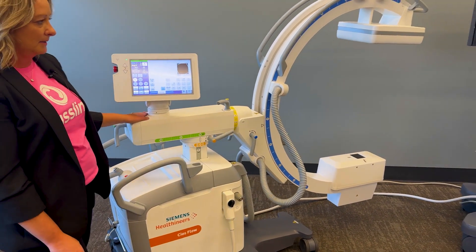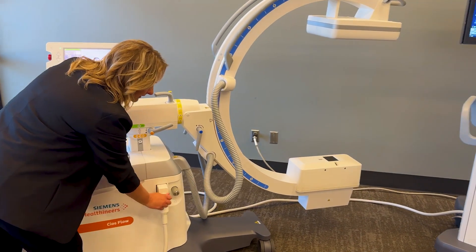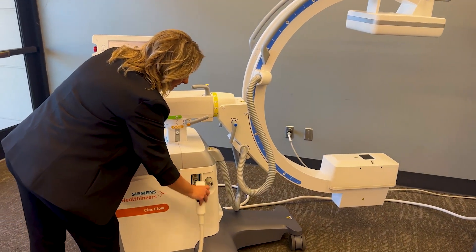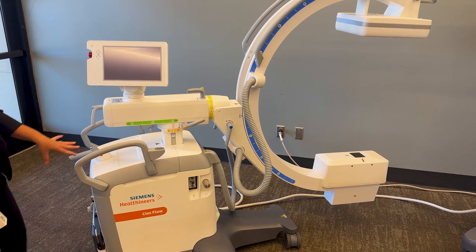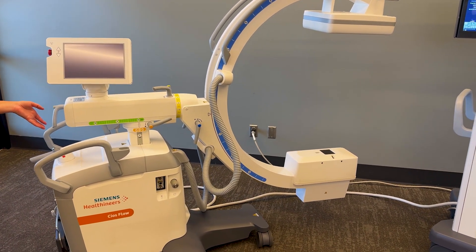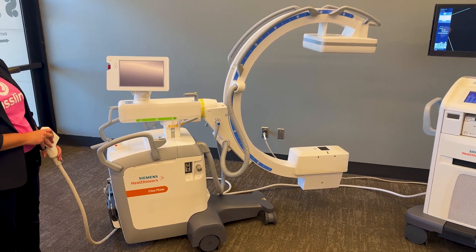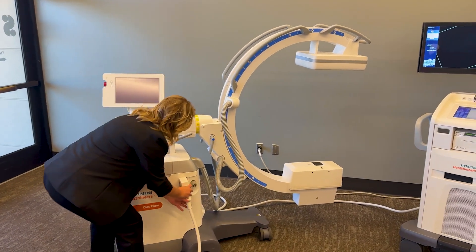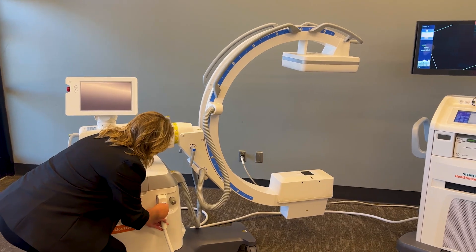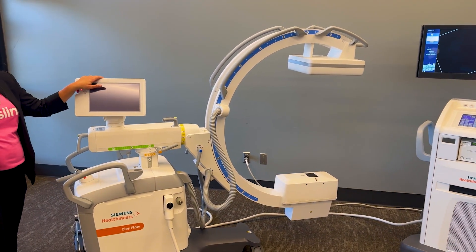You do have the capability of disconnecting your C-Arm from your monitor cart at any time during the procedure if you need to move your C-Arm to the other side of the room, or get it out of the room at the end of the procedure and allow the patient stretcher to come in and get the patient off the table. If you need to reconnect the C-Arm, it takes about 60 seconds to boot back up.